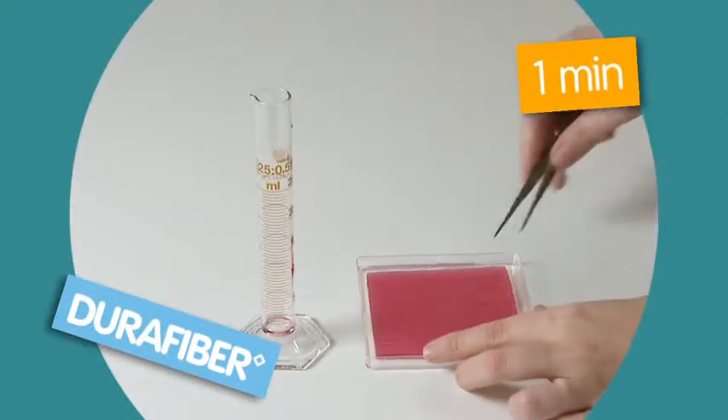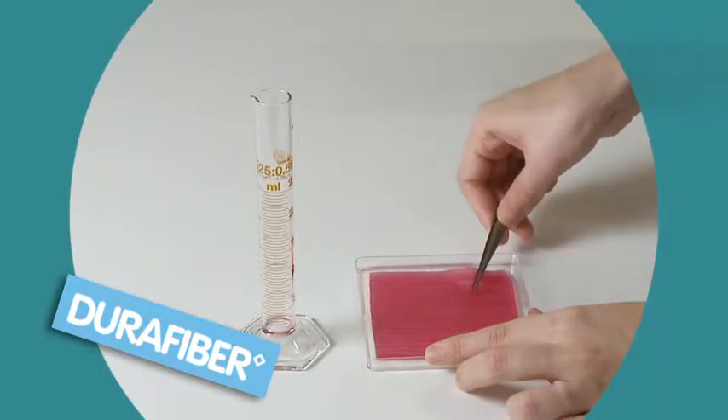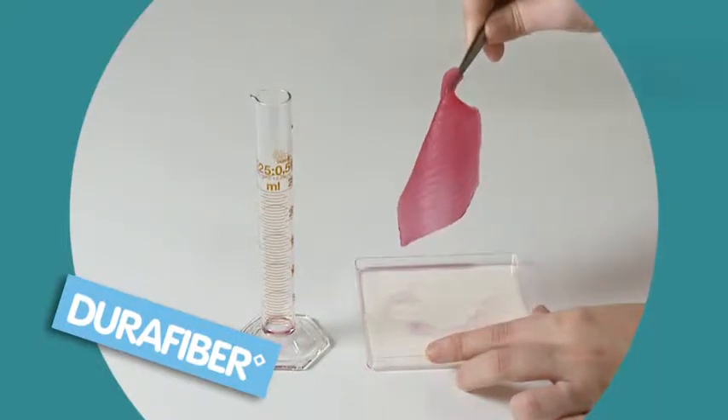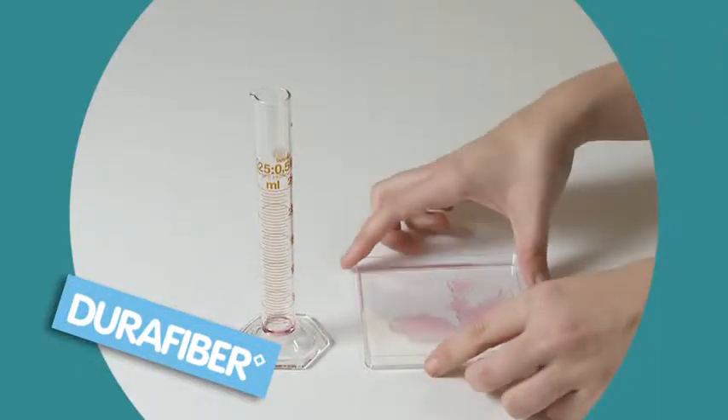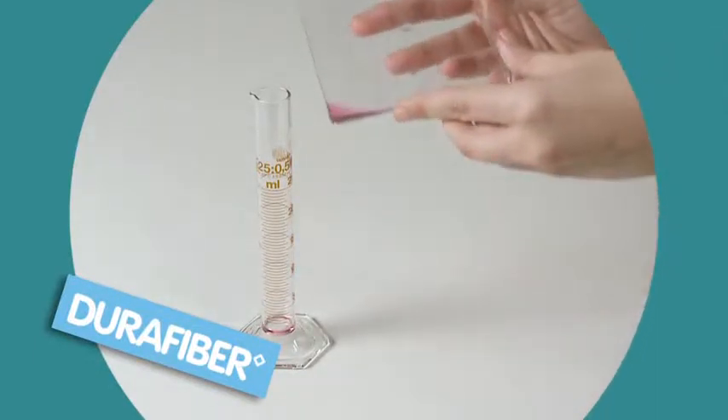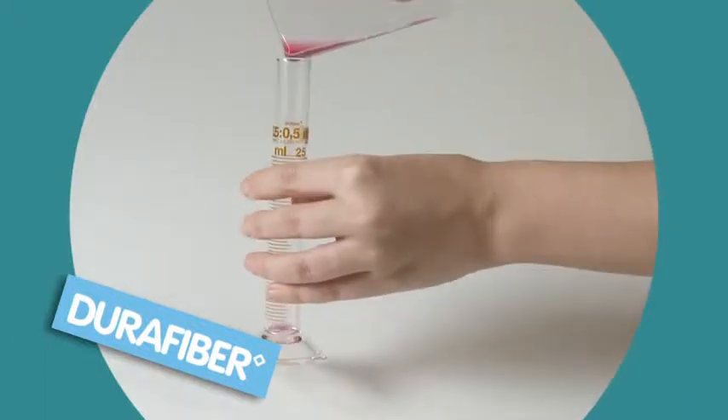After one minute the dressing is lifted out of the petri dish and allowed to drip dry for a further 30 seconds. The excess fluid that hasn't been absorbed by the dressing is poured back into the measuring tube.